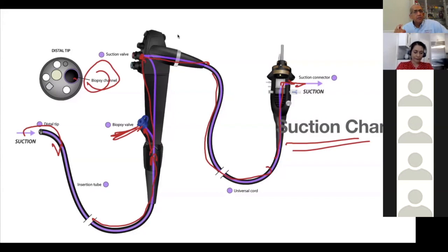And the reason why you have to think about long multiple turns is when you clean the channel, you have to think about whether you can touch the surface when there is an angulation with your brush. So if you don't touch a particular surface, you are going to leave that surface contaminated and a biofilm will develop.